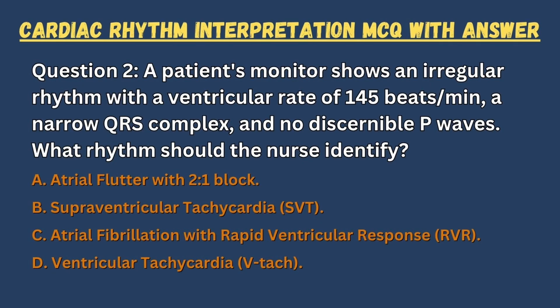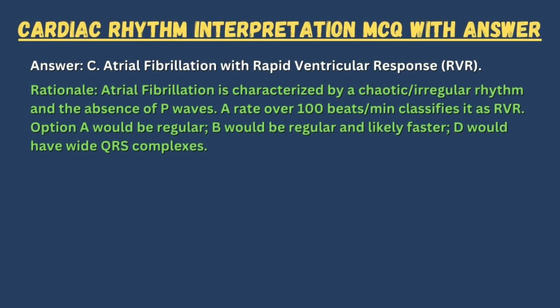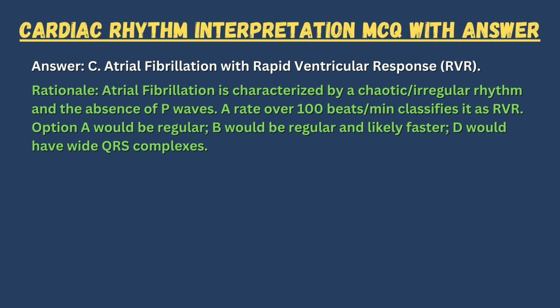A. Atrial flutter with 2:1 block. B. Supraventricular tachycardia, SVT. C. Atrial fibrillation with rapid ventricular response, RVR. D. Ventricular tachycardia, V-Tach. Answer. C. Atrial fibrillation with rapid ventricular response, RVR.